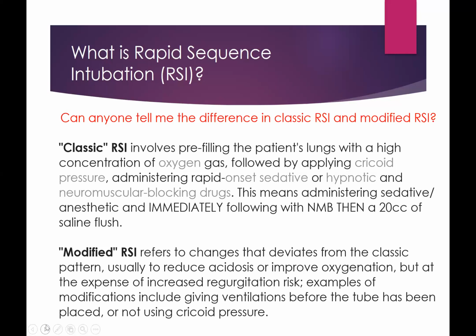So this is really, for the most part, reserved for patients that simply won't tolerate classic RSI. And oftentimes, somebody may start with the idea of, I'm going to do classic RSI and we're not going to bag. And if the patient begins to decompensate and begins to desaturate from an oxygen standpoint, you may transition to modified RSI in order to provide a little bit more of a barrier. But for the most part, this is definitely something that I try to assess prior to initiating an intubation procedure.